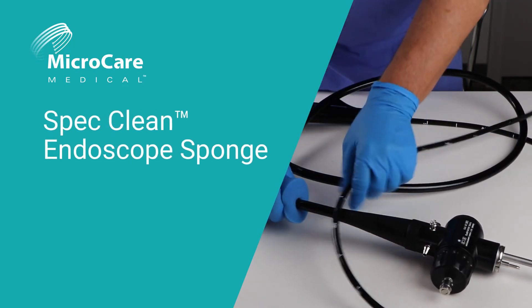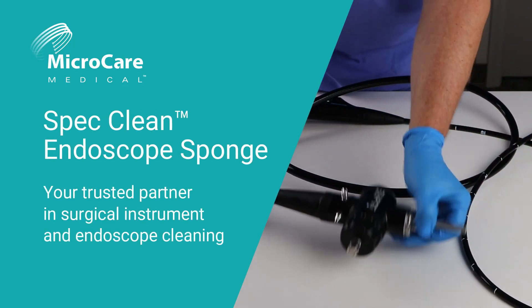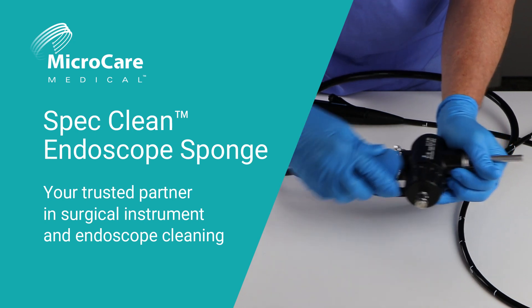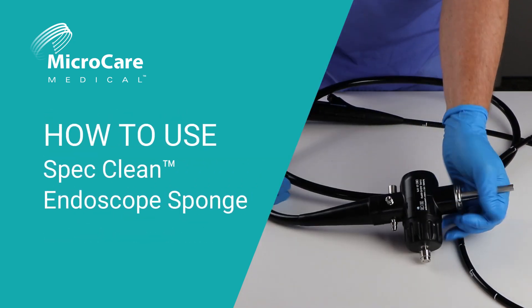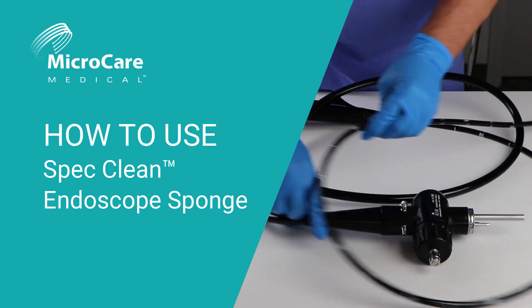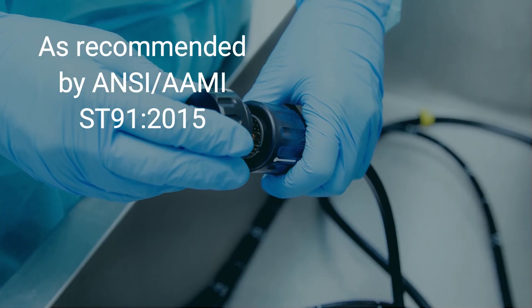Welcome to MicroCare Medical, your trusted partner in surgical instrument and endoscope cleaning. In this video, we'll show you how to use the SPEC Clean Endoscope Sponge for immediate pre-cleaning of endoscopes, as recommended by ANSI standards.